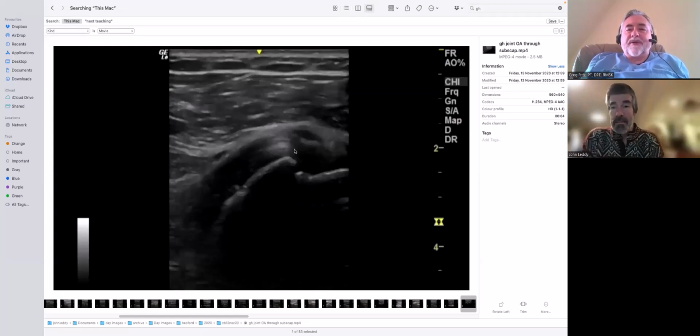John, as always, thank you for your time. I know I threw out brachial plexus because I had a scan today of that, and of what relevance is the thickened nerve roots that are going through what looks to be... I tell you what, I just don't know the utility of it. I think more than anything, as a guide for anesthesiologists and pain specialists, to deliver the product where it needs to be. Yep, I can see the value in that.